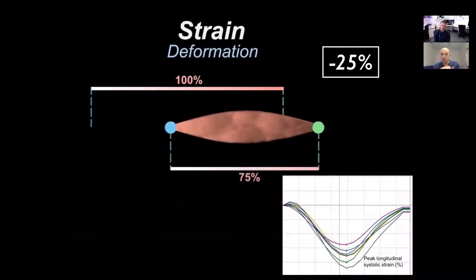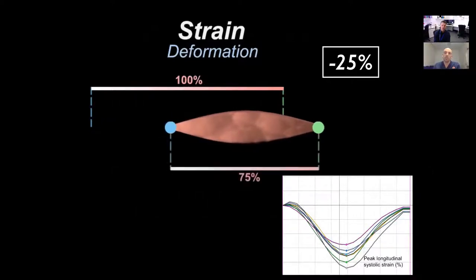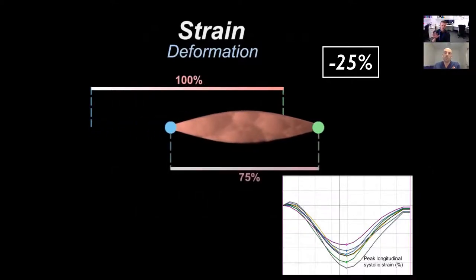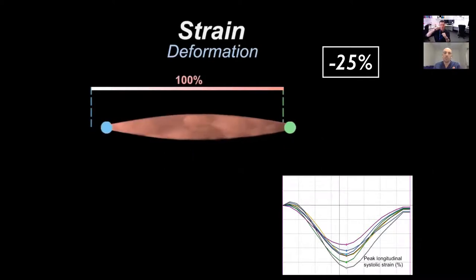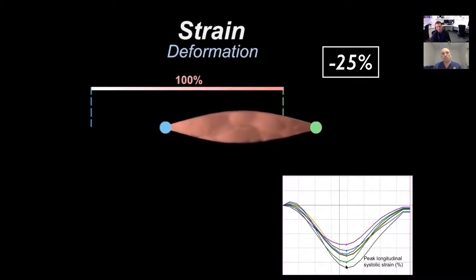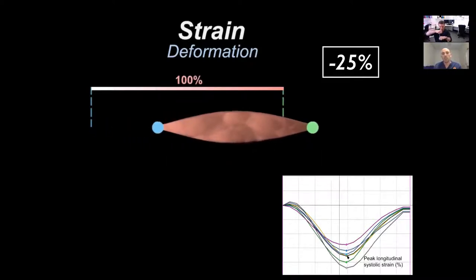We look at one cardiac cycle separated into six segments when analyzing the apical four, apical two, or apical three chamber views. We track the kernels as they come together — they start at zero, come down to peak longitudinal strain at the bottom, which is when the muscle fibers are closest together, and then go back out and should finish where they started.